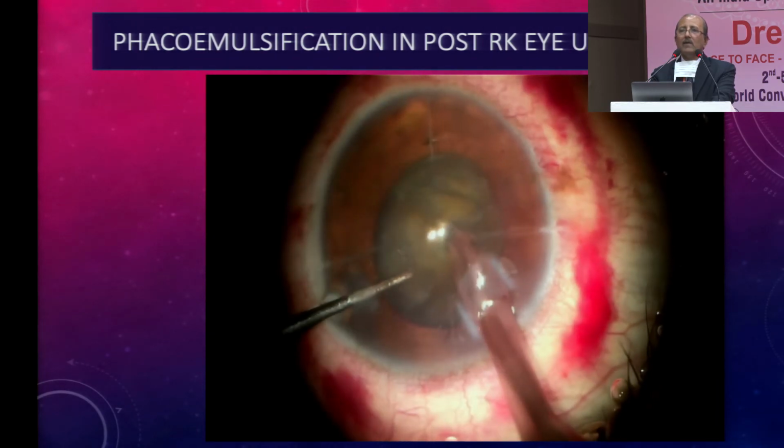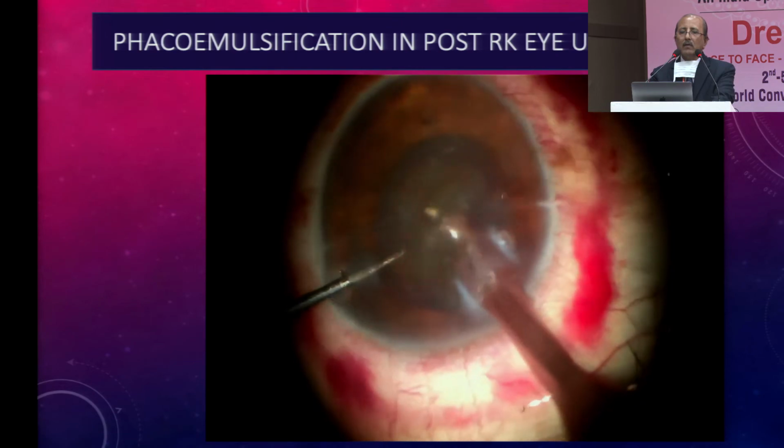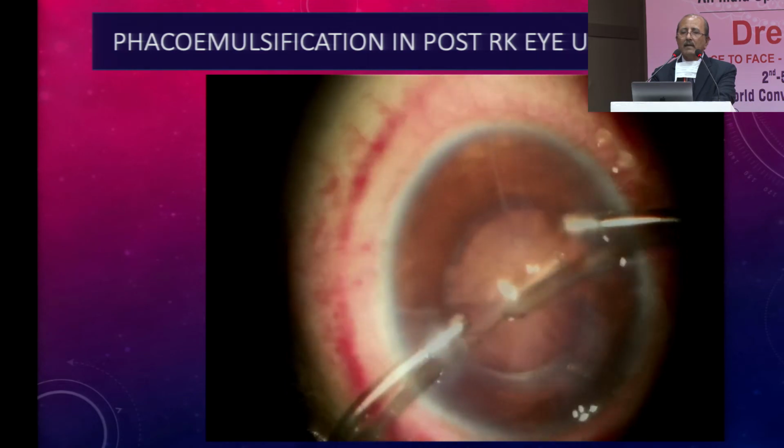This is one of the eyes while we were doing a trial of control with the normal method. This surgery was done about 4 or 5 years back.